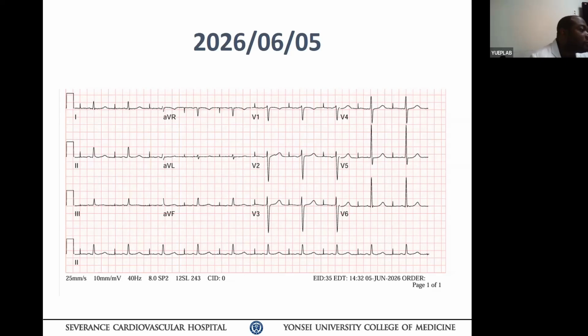Like we had a guy named Charles Swadlow who did the pacing work. He did all that, so we didn't care too much about it. But it is an important concept to know that there's also regional delay. You're talking about a non-normal, scarred heart. So you pace here, you conduct normally until certain points, and then blocks and conduction delay occur later. That's why sometimes you see pacemaker-induced arrhythmia.